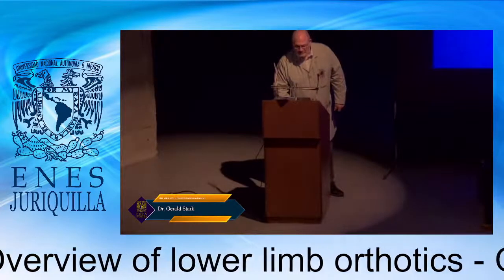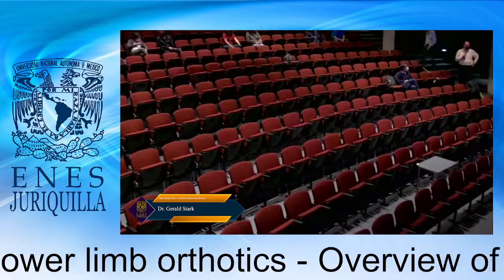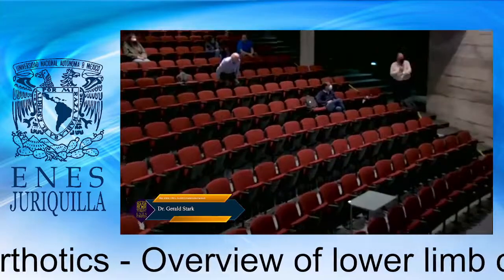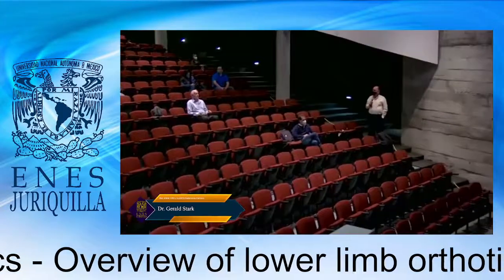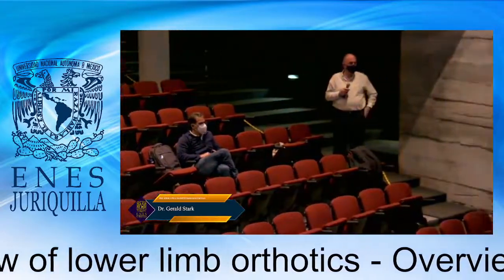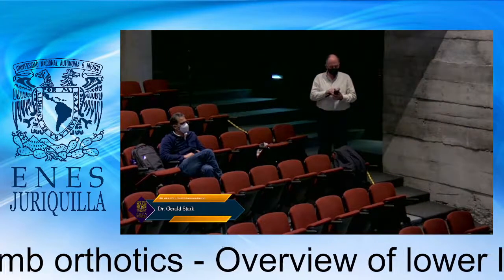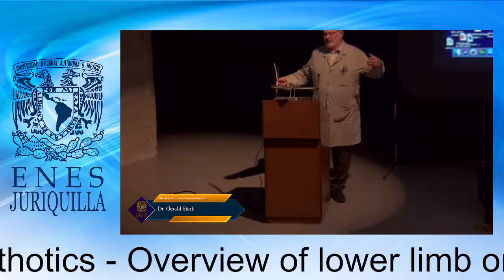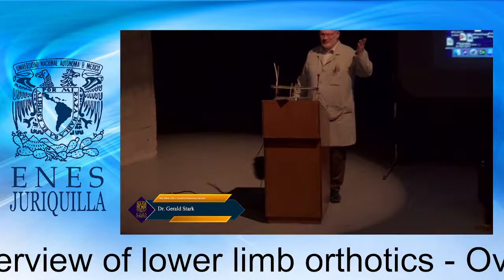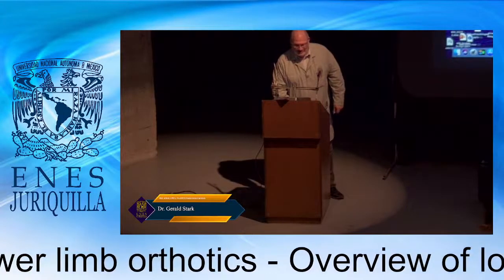We know that this world of orthosis is very complex, and one of the questions was, I think that you have answered, what is easier to do, a prosthetic device or an orthotic device? As an engineer, I would say the easier thing is a prosthetic device, because with prosthetics, it's one pathology, amputation, but many different components, some equally valuable. With orthotics, we can have hundreds of pathologies, but only maybe 3 choices in terms of componentry. So that's what makes it a little bit more challenging.